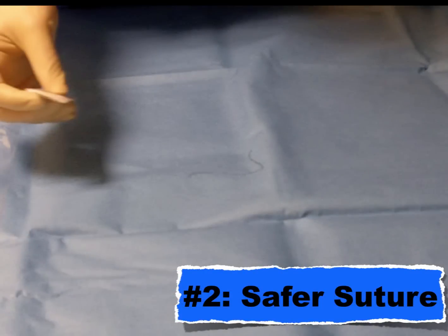Every year I see trainees getting stuck with needles as they're placing central lines — often they're diving their hands down into deep, dark spaces and they grab the tip of the needle. This makes me cringe. So next time you're suturing in a central line, consider taking the paper or plastic sheath that the needle comes out of and using it to guide the tip of the needle out, so you can grab the needle in the middle of its length — not at the tip — and risk puncture.